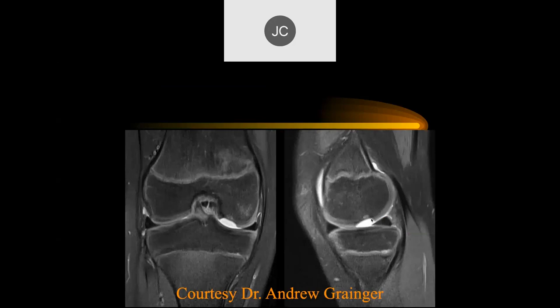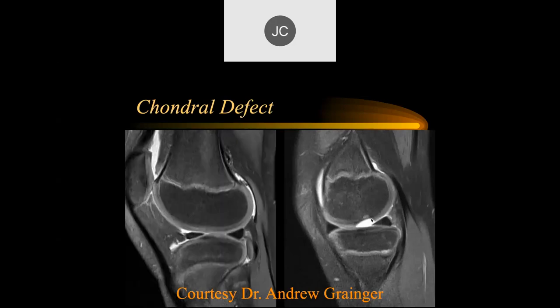We have a coronal and a sagittal of the knee — there's a full thickness cartilage defect of the lateral femoral condyle. What would you want to do next? Look for that fragment. There it is. If it's really acute, especially in young kids, the fragment may still be viable.